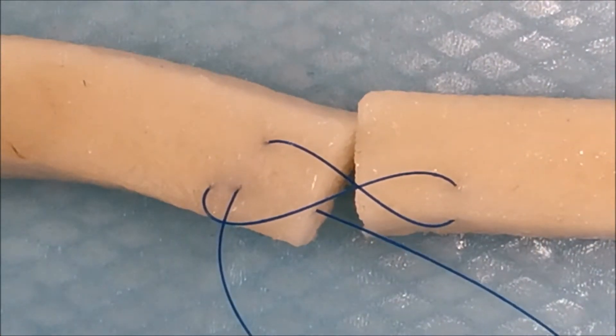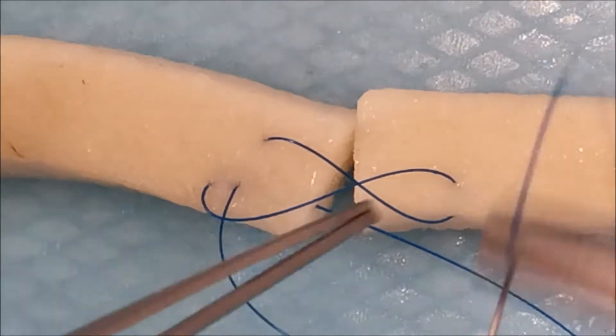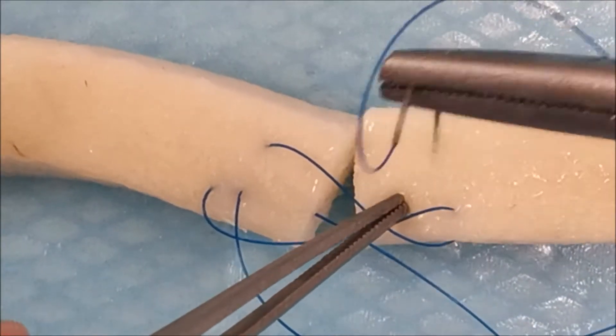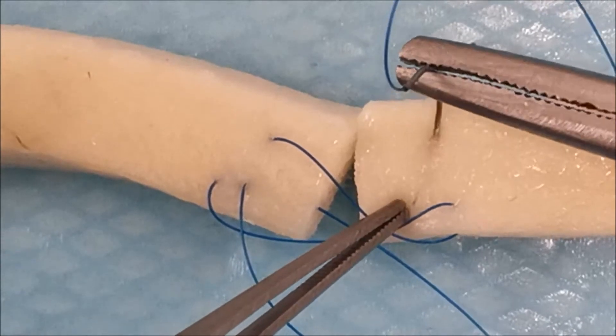You create a continuous running figure of eight lattice net-like structure around the tendon.